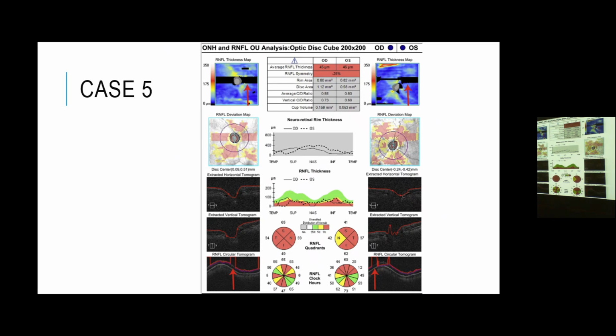What do you think about this test? Looks like this black band looks like an artifact. Okay. So black is 0. Yeah. So here you can see touching the baseline. All these are artifacts. You can see here the alignment of the machine. It's not accurate. All of this thinning is because of missing data. Okay.